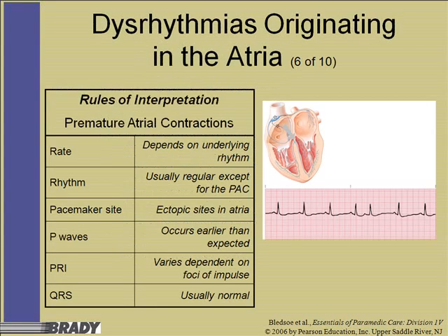Premature atrial contractions, or PACs. This is just where we have a little difference in the atrial jump, or the kick, if you will. We're looking at our complexes here. The first three look pretty normal, pretty much the same. The fourth one, and then we get into the fifth one. We've got a quicker contraction that's been premature there before what we would have expected.